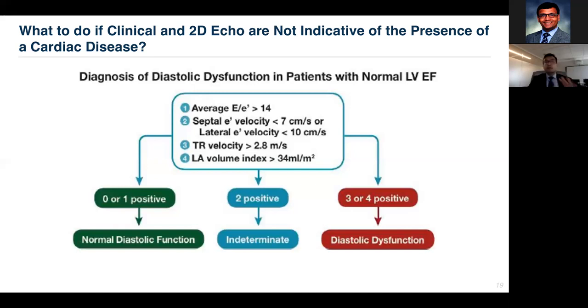So the consistency of information is important, and not relying on a weak data set is very important. Do not be afraid to call it indeterminate or to ask for more help, which is the right thing to do, particularly if the clinical situation is still ambiguous.